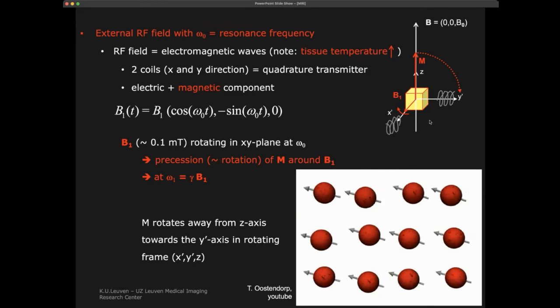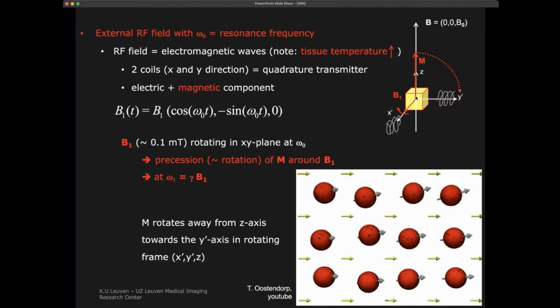But at this moment, what is important is that the coordinate system is actually the coordinate system of the scanner. What you will see later on is that a magnetic resonance scanner is actually a long tube, and the direction of the tube, that is this Z component, because that's where we create a magnetic field. So a basic magnetic resonance scanner is like one large permanent magnet.